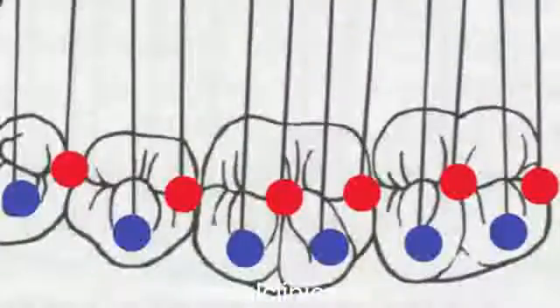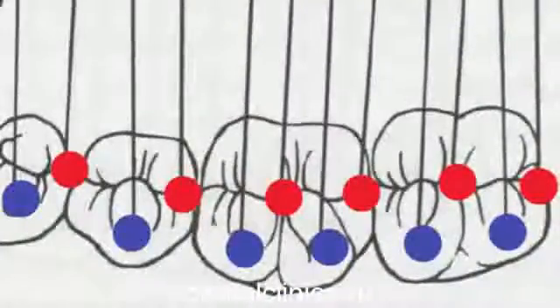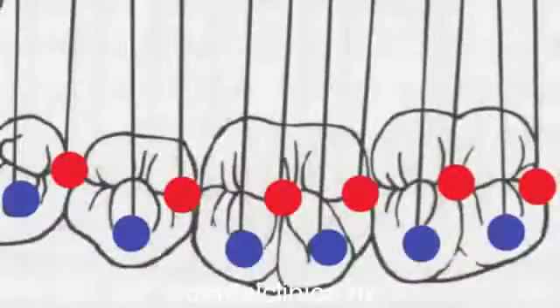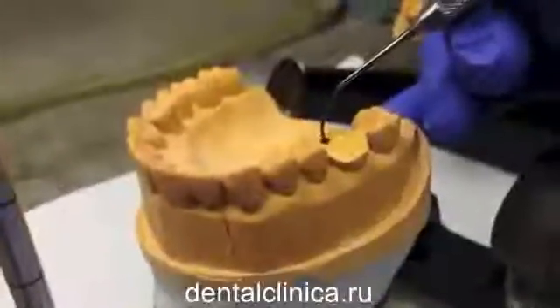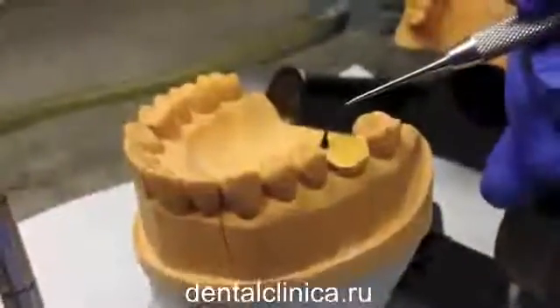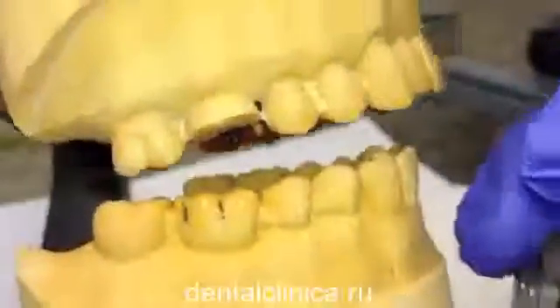Shown, the red markers represent the receiving areas, and the blue markers represent the supporting cusps or stamp cusps of the mandibular molar. We will be building up tooth number 3 using the wax drop technique. This means that the wax will be built up to occlusion with minimal carving.